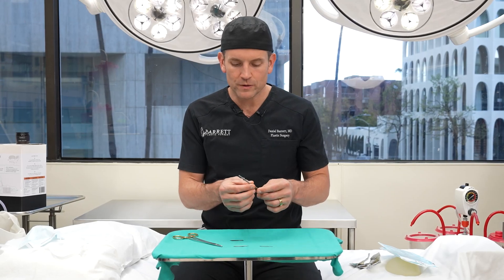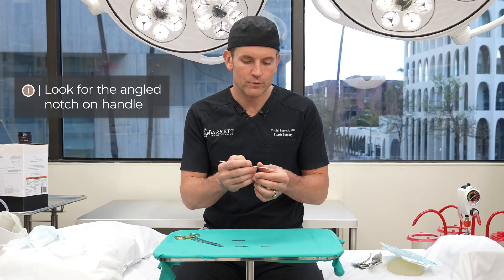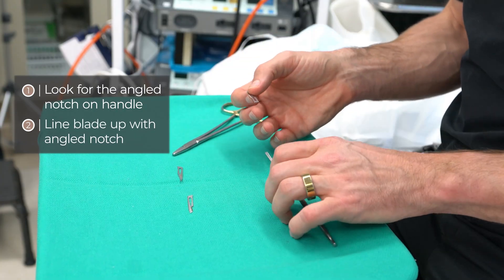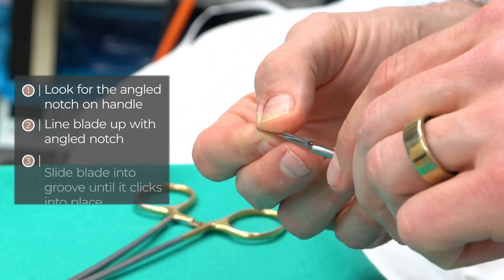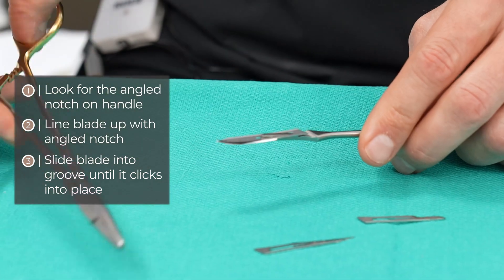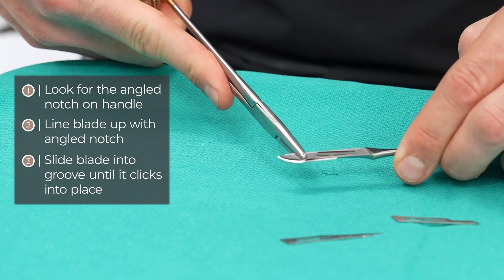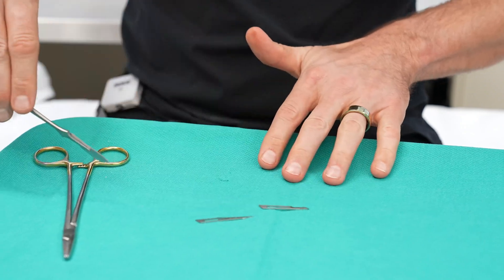First thing you want to do is get familiar with your scalpel handle. There's a certain notch at a certain angle here. You want to make sure that that little notch lines up with your scalpel blade. You can do it with your fingers, but I don't really recommend doing that. You slide it onto this groove right here. If it gets stuck, or if you want to do this right — for all you scrub techs out there — you take this and kind of push it on so that it clicks into place and is ready to use.